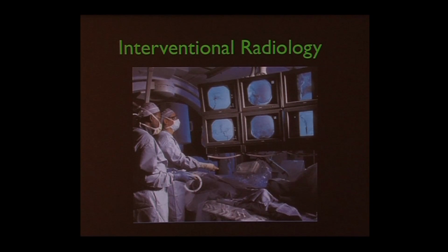And then I'm going to finish up with interventional radiology. It's a diagnostic tool. It's a way that we can also be detectives in giving a more accurate diagnosis, and we can also take it a step further and treat the patient without having to have them opened up. We can use catheters and probes and needles.